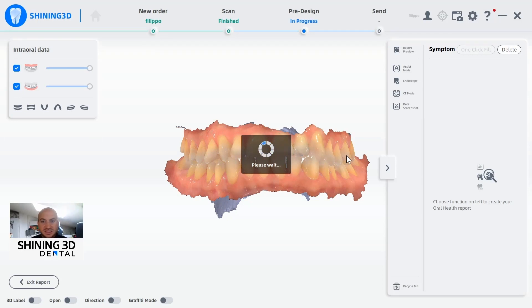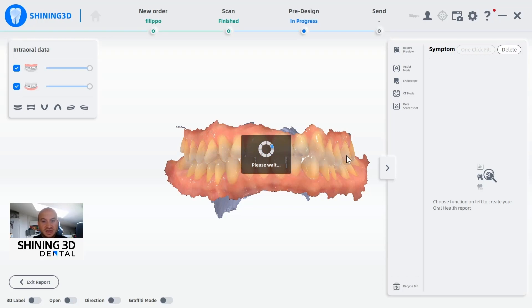Now the artificial intelligence is calculating, analyzing millimeter, decimeter, micrometer per micrometer the whole surface that we scanned. It is necessary to wait around 20-30 seconds in order to permit the artificial intelligence to study deeply the whole surface.